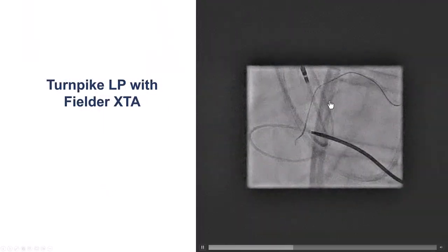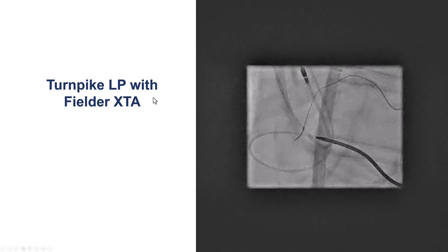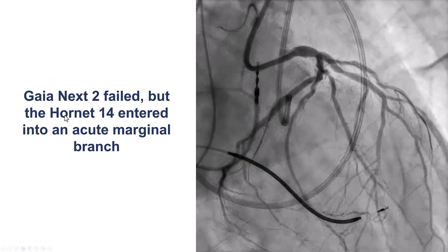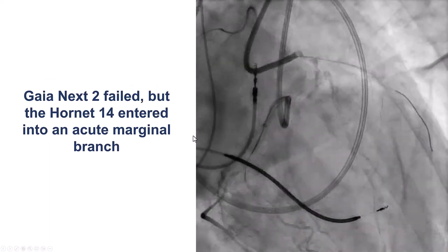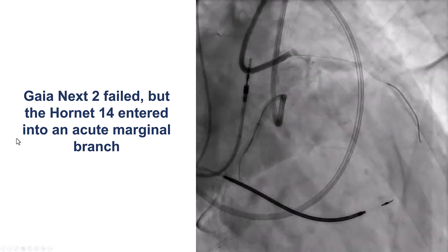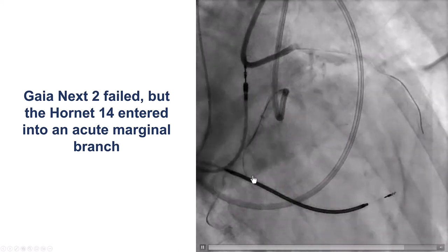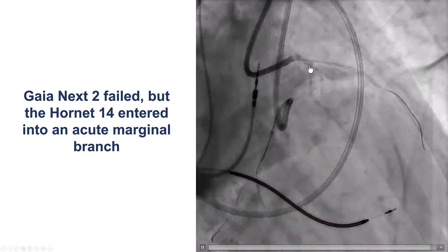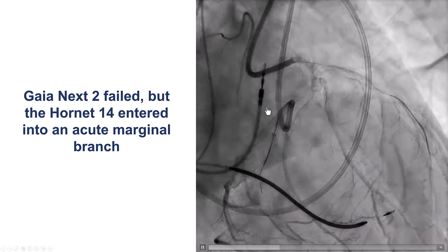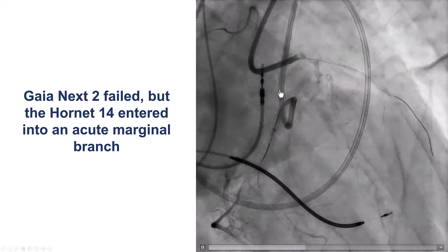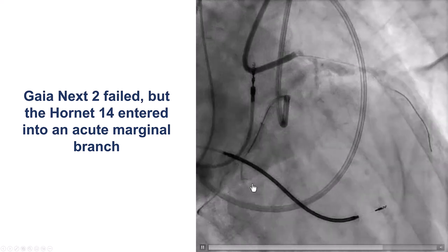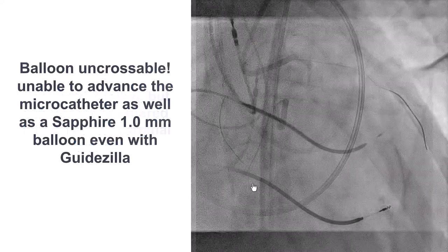Here is antegrade wire escalation: Turnpike LP, Fielder XTA — did not make much progress. We then escalated to a stiffer guide wire; this is a Hornet 14 that went into an acute marginal branch. This emphasizes the importance of having an RAO view and orthogonal views to make sure we understand the course of the guide wire and the vessel.